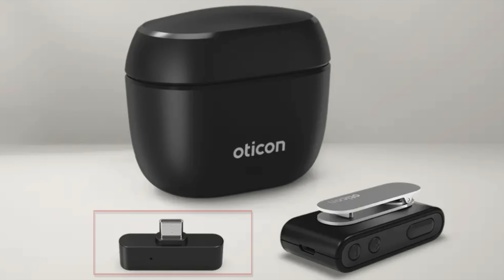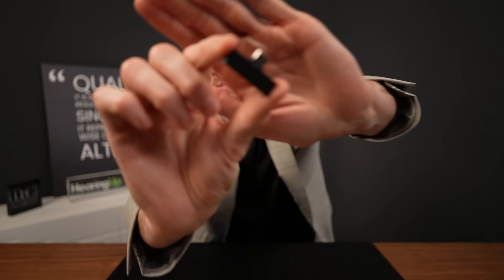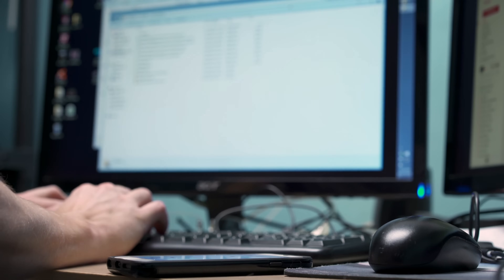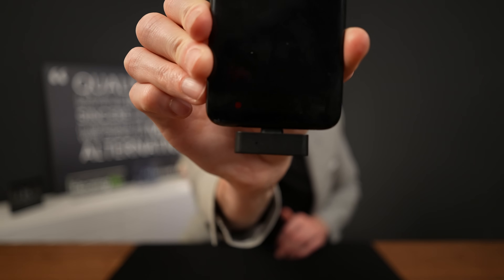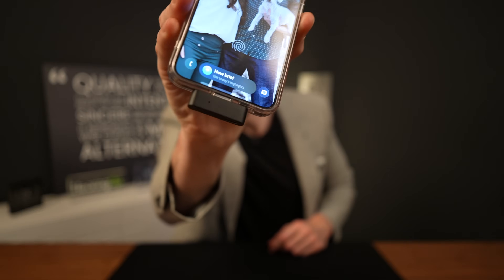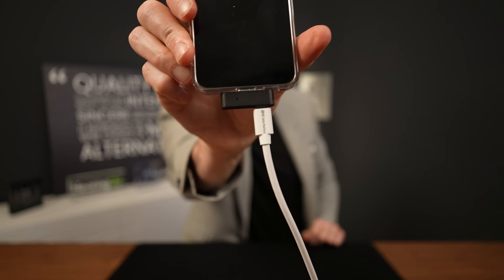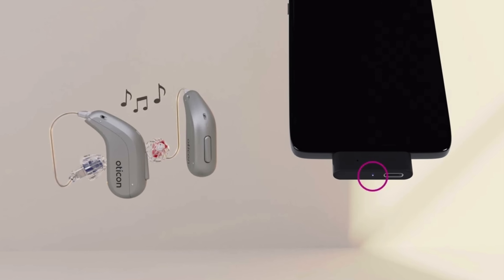I've been testing this new Easy-LE adapter from Oticon, and I have to tell you, this thing is amazing, but it does have a few drawbacks. Let's talk about the positives first. This thing is incredibly small and convenient to use. It uses a USB-C connection, which is compatible with most electronic devices at this point. You just plug it directly into your smartphone, laptop computer, desktop computer — whatever the case may be — and it will be directly compatible. It has about two millimeters of relief on the bottom, so you can easily use it with a case as well. It also has pass-through charging on the bottom, so you can plug it in and still have a charging cable plug into the bottom, and stream audio into your Oticon hearing aids while charging at the same time.